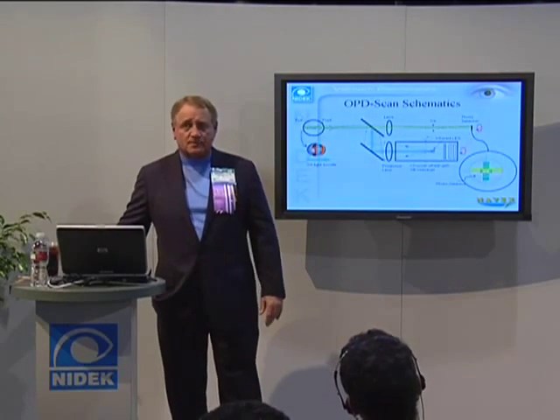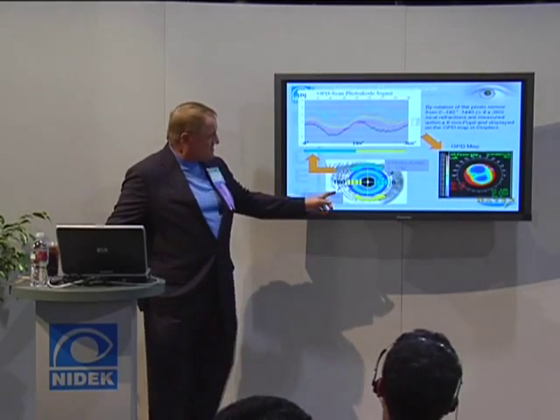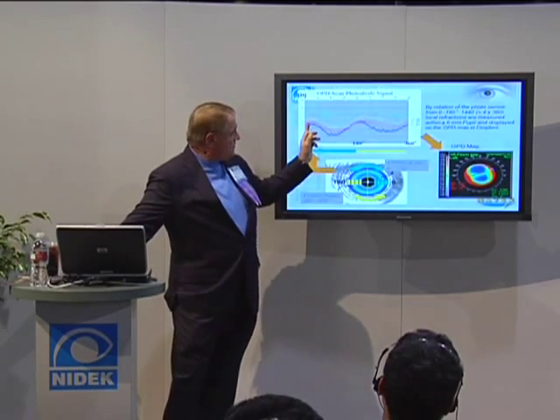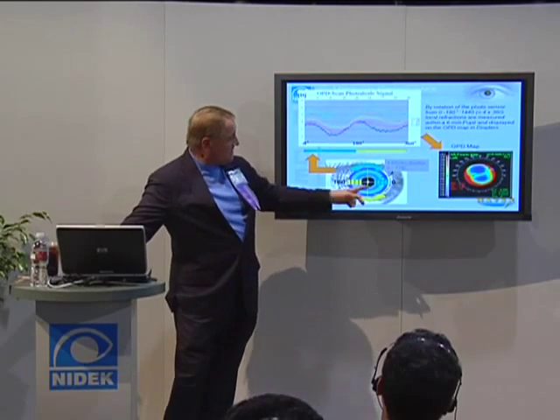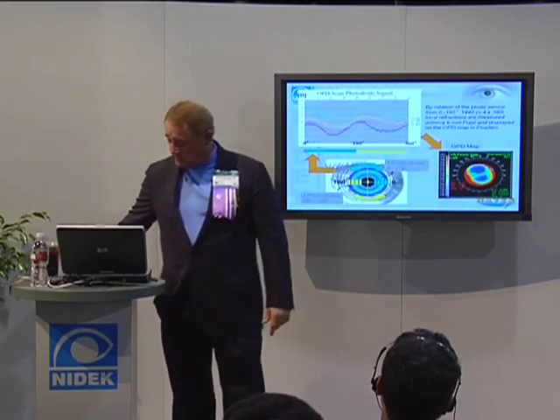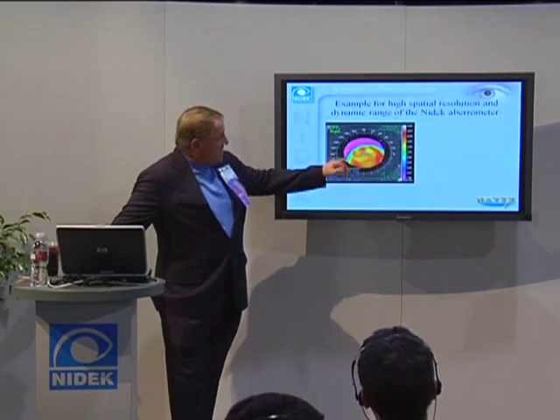That's what it does. Now, when we do that, what I was saying is this thing rotates around 180 degrees, and we're not going through all the math, but basically from this one point, when it is in one position, it takes it to all points, and now it can figure out what the refraction is on this patient by looking at that little sine wave and get the axis and the magnitude of a patient's sphere and cylinder by doing that. All right, here's an example.